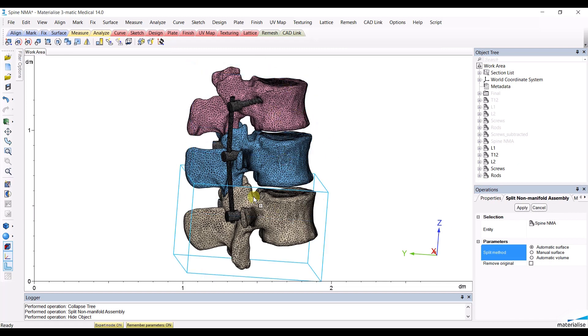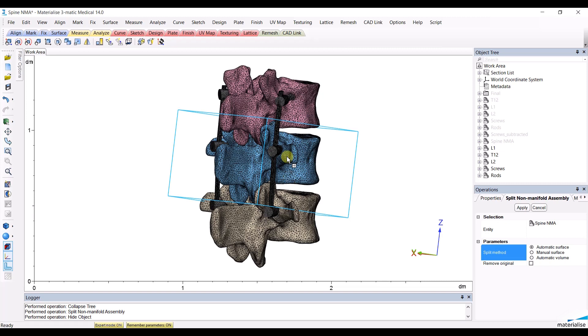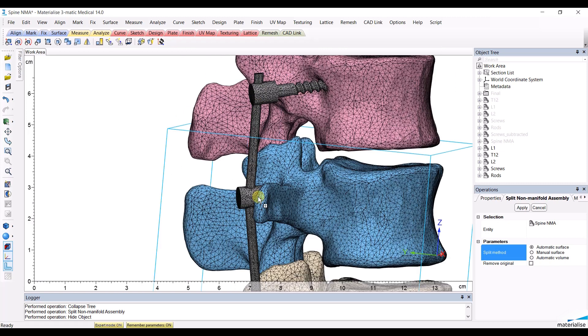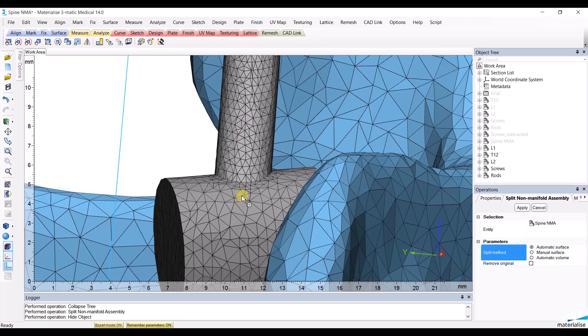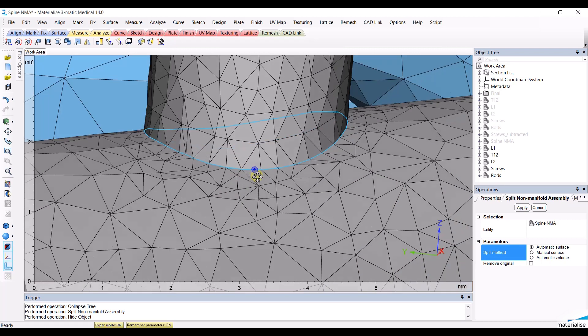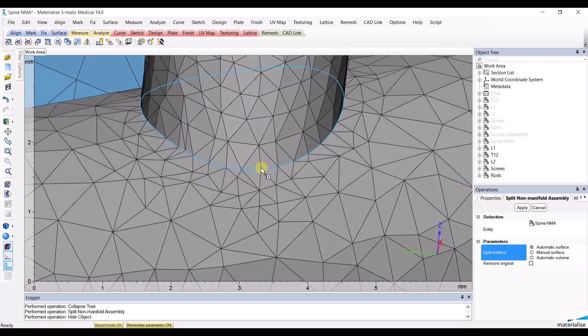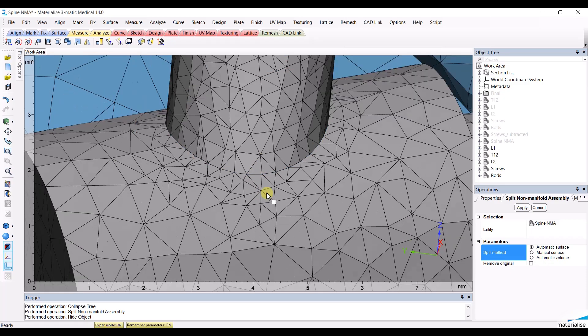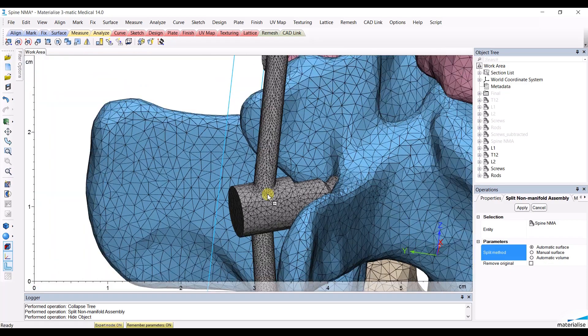Three vertebrae, one object for all the screws and one object for all the rods. They now all have the desired mesh with the triangle nodes that are corresponding at the intersections.